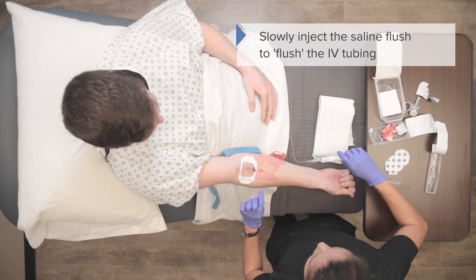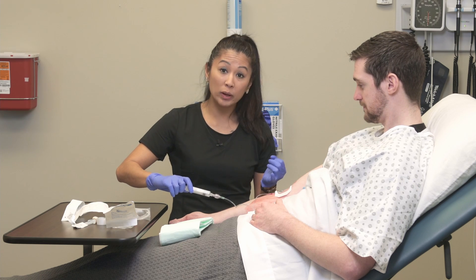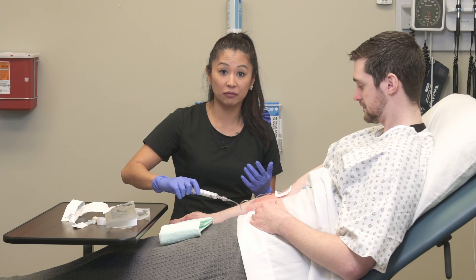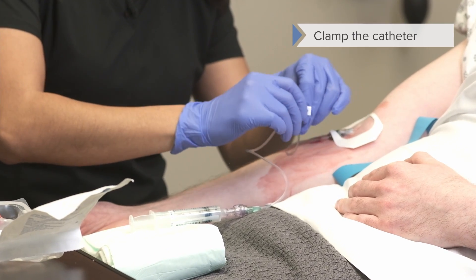When I flush the vein, I see there's no blebbing. I also asked the patient if there was any pain when I flushed — and there was none. So we want to make sure it's not blebbing or leaking at the site, and it's not painful for our patient. This is nice and flushed.